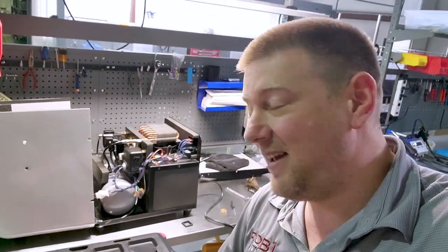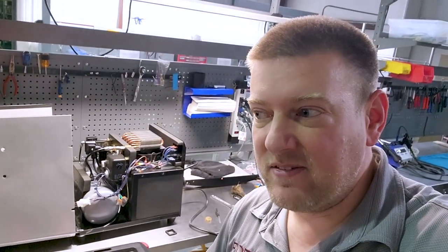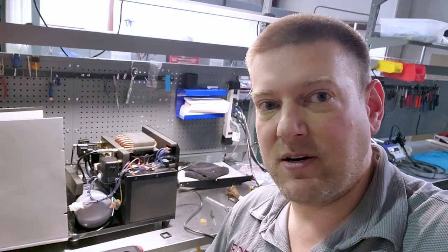Anyway, guys, I've never seen a problem like that before. It's interesting. It's a simple fix, really. It doesn't really require very much, and the parts should be readily available. But I should tell you, you have to check those ground connections, and you have to make sure your electrical safety is on point, because these devices that operate on mains can be fatal if you're losing your ground conductor. It's kind of crazy.